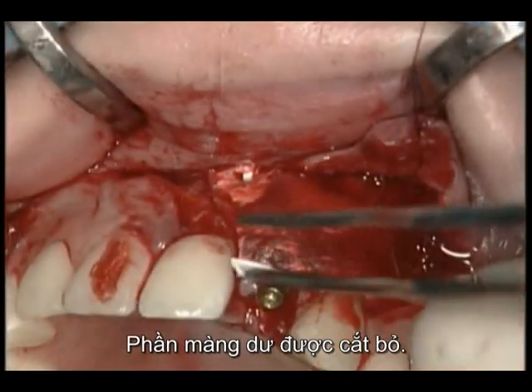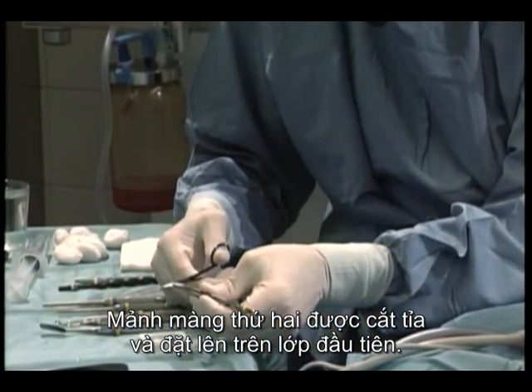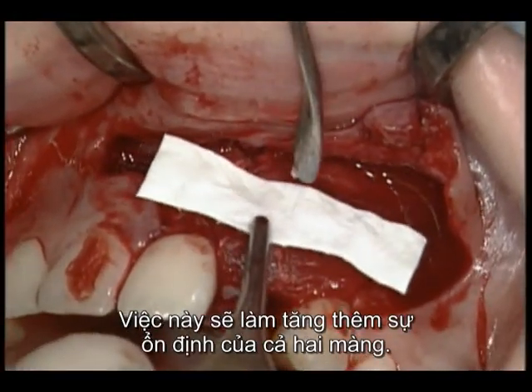Excess membrane is trimmed away. A second strip of membrane is cut and positioned over the first layer. This further improves the stability of both membranes.